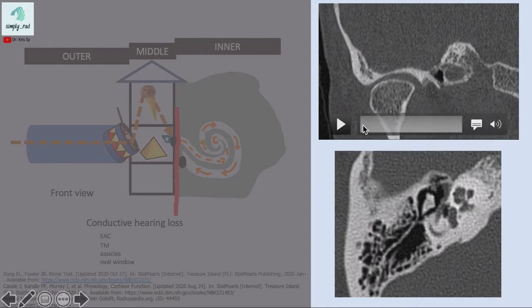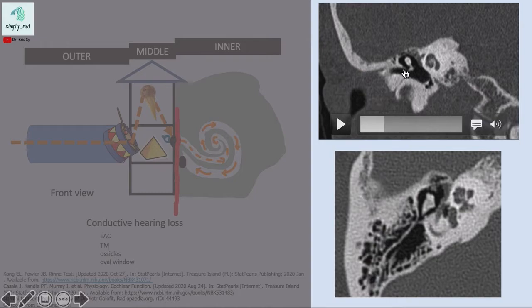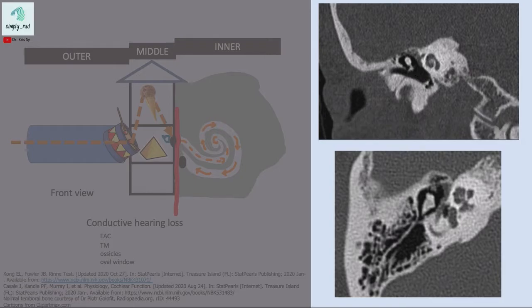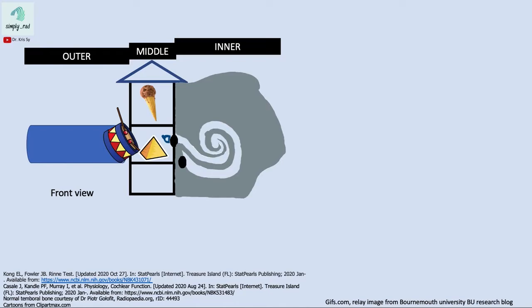We're going to look for the cut where we can see the scutum, since this is the attachment of the tympanic membrane. Here we have the sharp scutum — the attachment of the tympanic membrane superiorly — which is the landmark separating the outer from the middle ear. Vibrations in the air are collected by the external ear, funneled through the canal and onto the tympanic membrane.